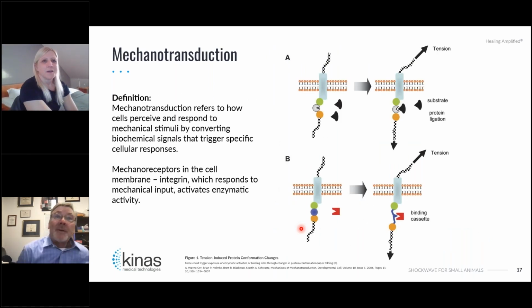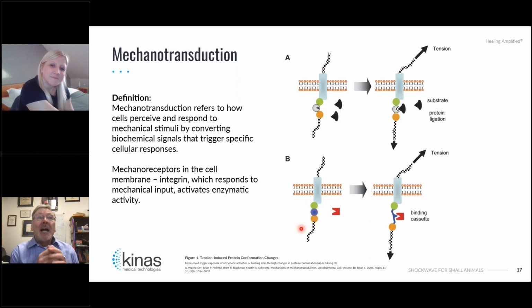And I think, if I can add just one thing in 1 second, a common description that's used, and maybe this is where the hammering might come from in the States, is that people think of a radial as more of a shotgun, where it's spreading out over a big area, treating a large area, but not being super selective at any one spot, whereas with the focused, you're saying this is exactly where I need it, and we're focusing it at that point.